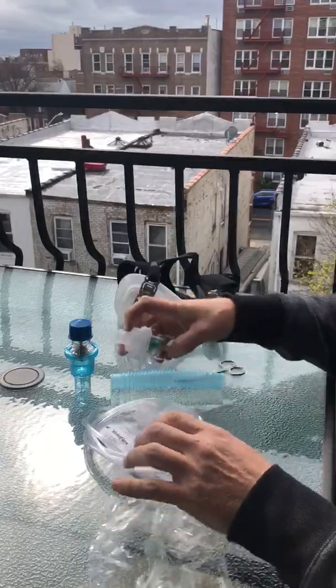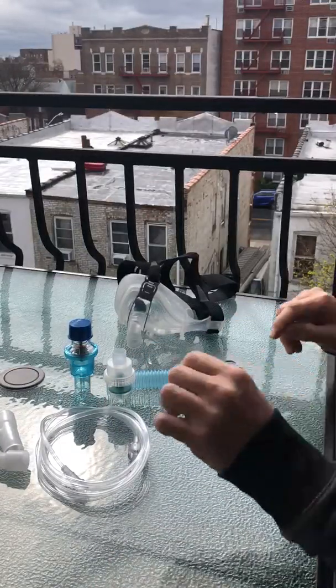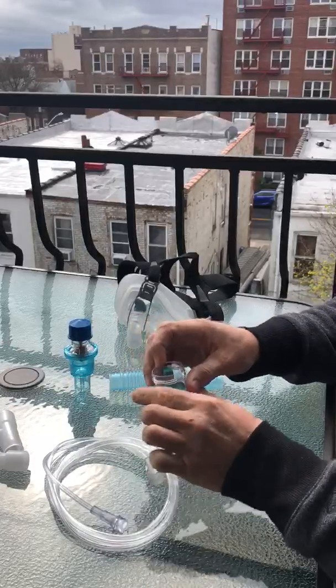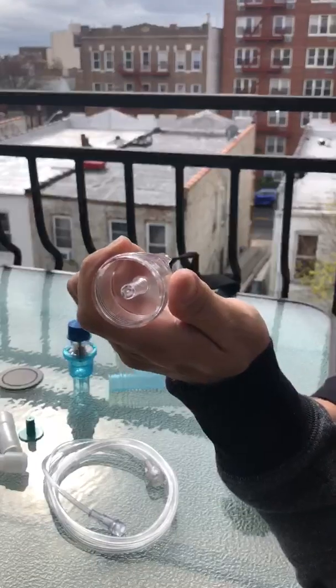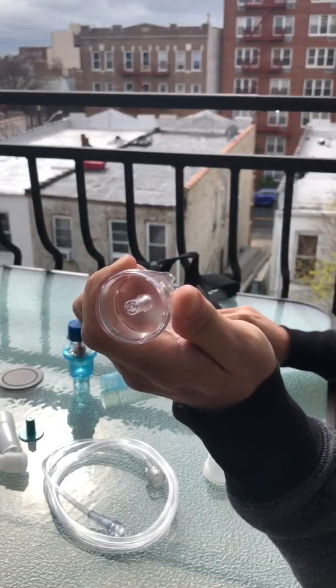We're gonna wipe all the parts because you're gonna use a bunch of them. First we'll start by opening up the nebulizer, taking out the nebulizer device, and you'll see that there's a little tiny hole in the nebulizer. We want to open that up to get full flow of oxygen.